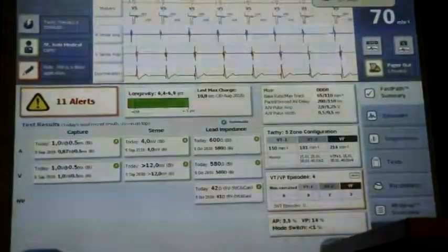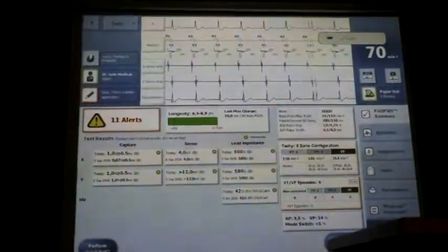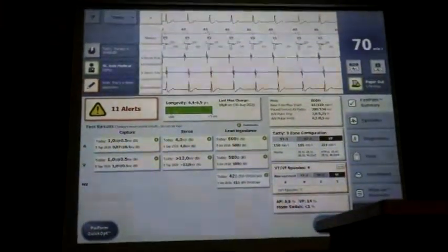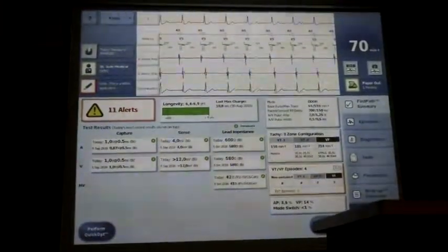Okay, so we've got the programmer. To get to the sensitivity, if I tell you, you will never remember, right? So you have to be able to find it yourself. If I told you to get to some place out there and gave you the directions, you won't remember. But if you understand, then it's easier, right? You remember. So it's part of the device parameters.